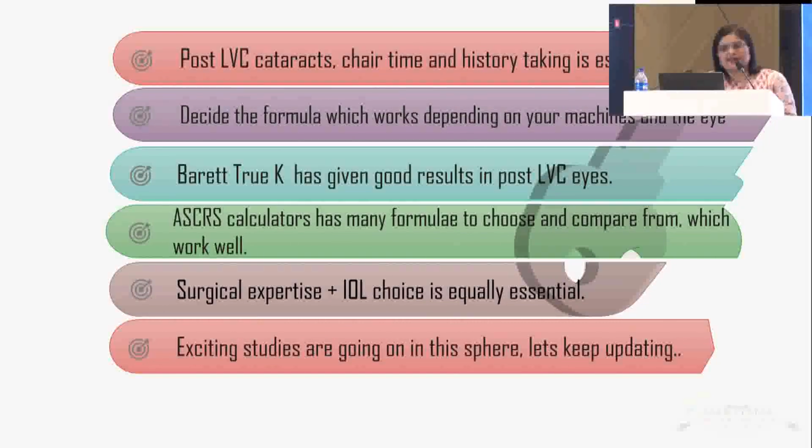We have to decide which formula will work depending on the machines that you have. Barrett True K has given good results in post-LVC eyes, and the ASCRS calculators are also equally good, with many formulae to choose and compare from, and they work well. Surgical expertise with IOL choice is very important, and exciting studies are still going on, and we are still learning every day. Thank you so much.